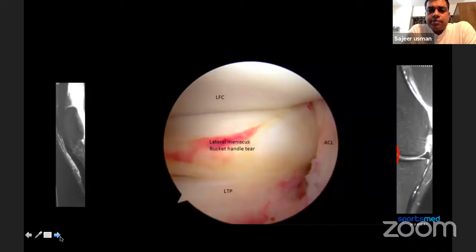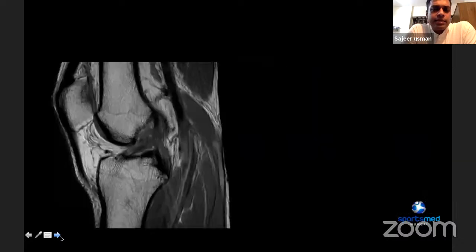This complicates things because on arthroscopic evaluation, after we got a little bit of his range back, we got into surgery and we found that his meniscus was completely rounded off, refusing to reduce, and we were unable to even get it back into position. This patient ultimately ended up with a resection. Early imaging could have probably saved his meniscus.